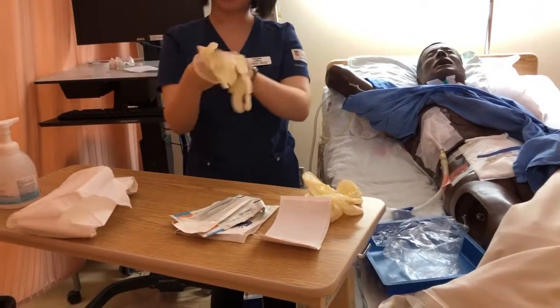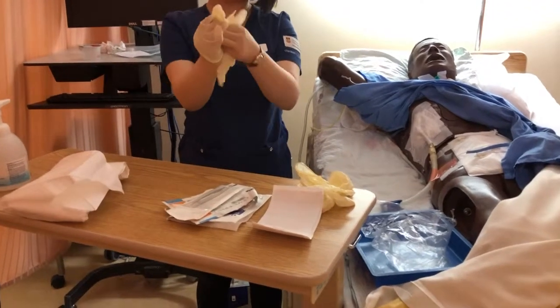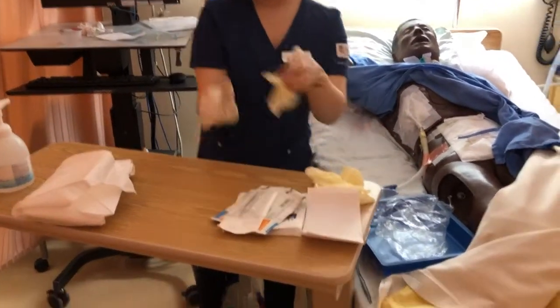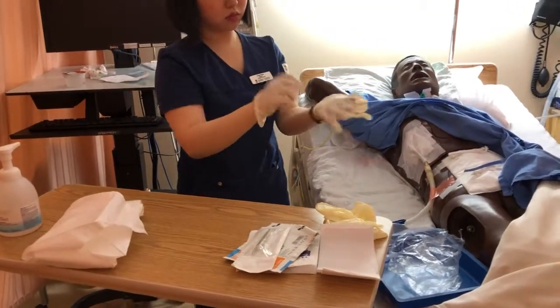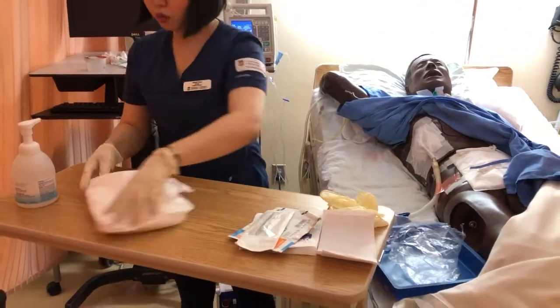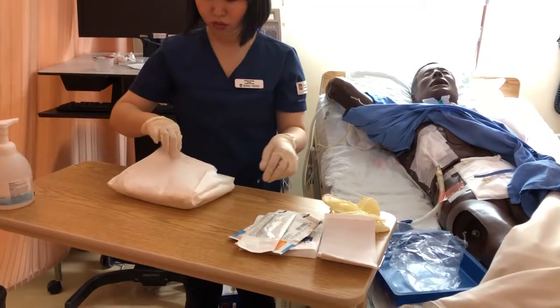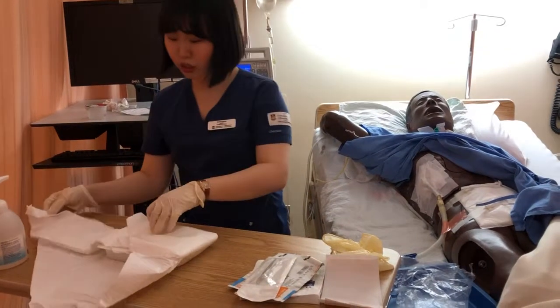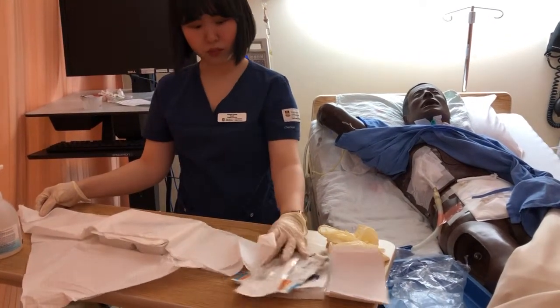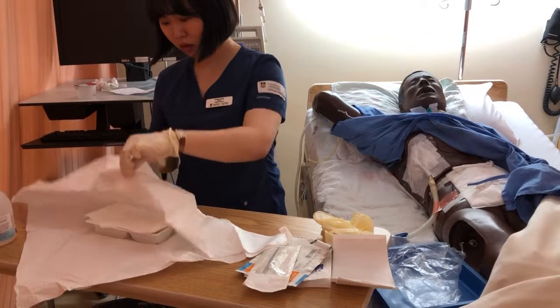I'm going to wear my gloves, and open my sterile field, and pour some more. Okay, I'm going to go ahead and put on a new pair of gloves.